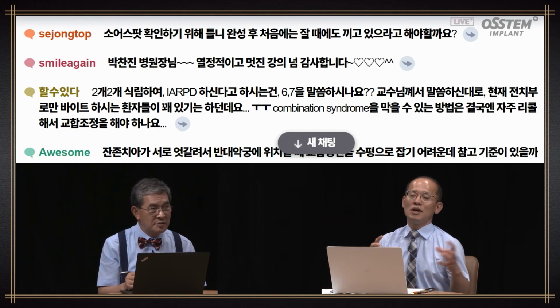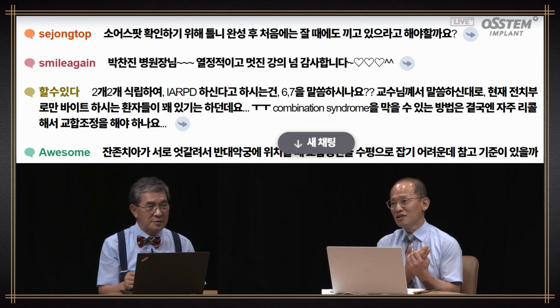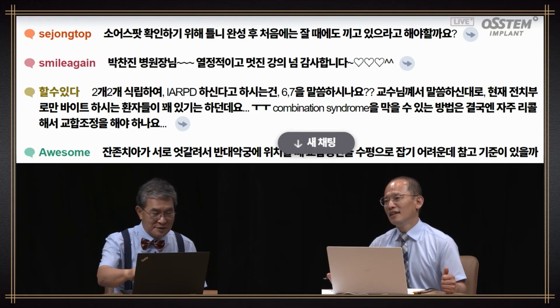So you just increase the time with the new denture continuously, and of course you check the occlusion and do some adjustment. So if you find discomfort, take the old one. So slowly increase the time with the full denture.